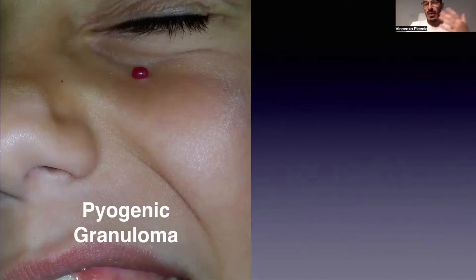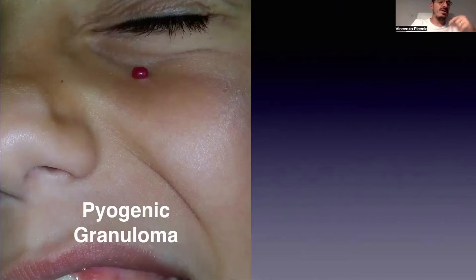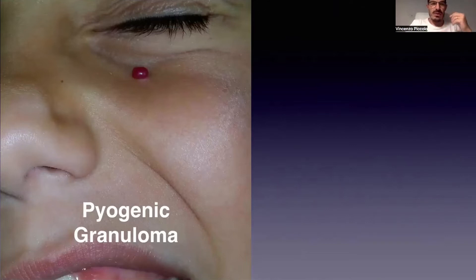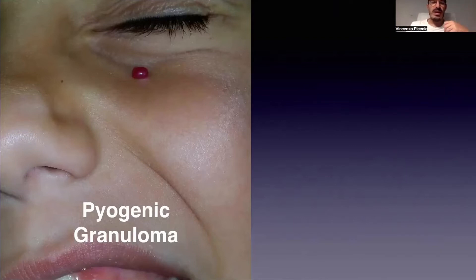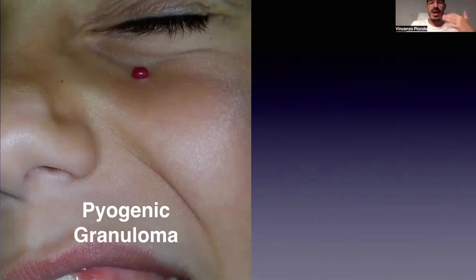When it's located at the face, like in these patients, we have many differential diagnoses from a clinical standpoint, but dermoscopy may play a very important role in helping with the differential diagnosis.